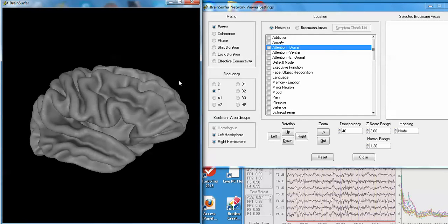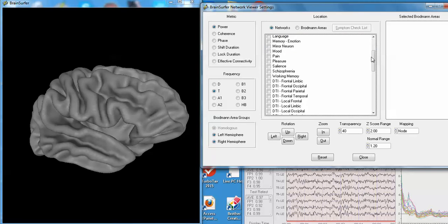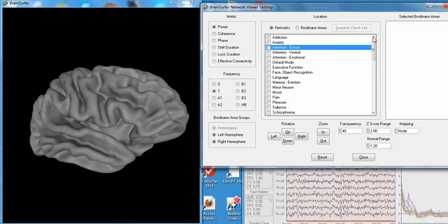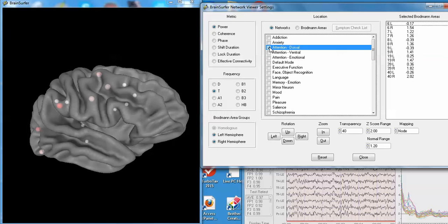So let's take a look at the attention network since we know his symptoms are there. I'm going to quickly click this selection of various networks you can see in this panel. It's all inside of NeuroGuide for other parts of NeuroGuide, particularly for neurofeedback. This is time for assessment. I'm going to look at the attention network. You can see the list of Brodman areas that represent the dorsal attention network.